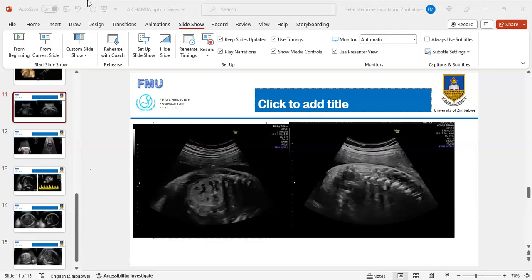Make sure that the pregnancy is well dated, because that is the most common mistake that you can make. Wrong dating will make the baby's head appear small. But if you are certain with your dates and the head is small, know that you are more likely not dealing with FGR by the strict definition of what an FGR is.